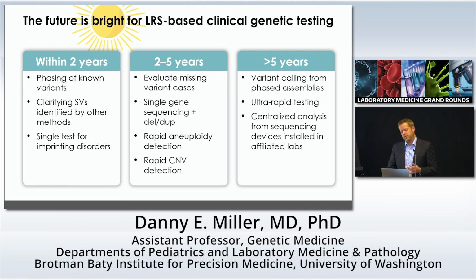Because the library prep can be simplified. You can think about microfluidic type devices that just take the blood and then run the sequencing for you. It can really help with logistics, right? How do you collect that blood? How do you transport it? Things like that. So things can be done a lot more quickly.